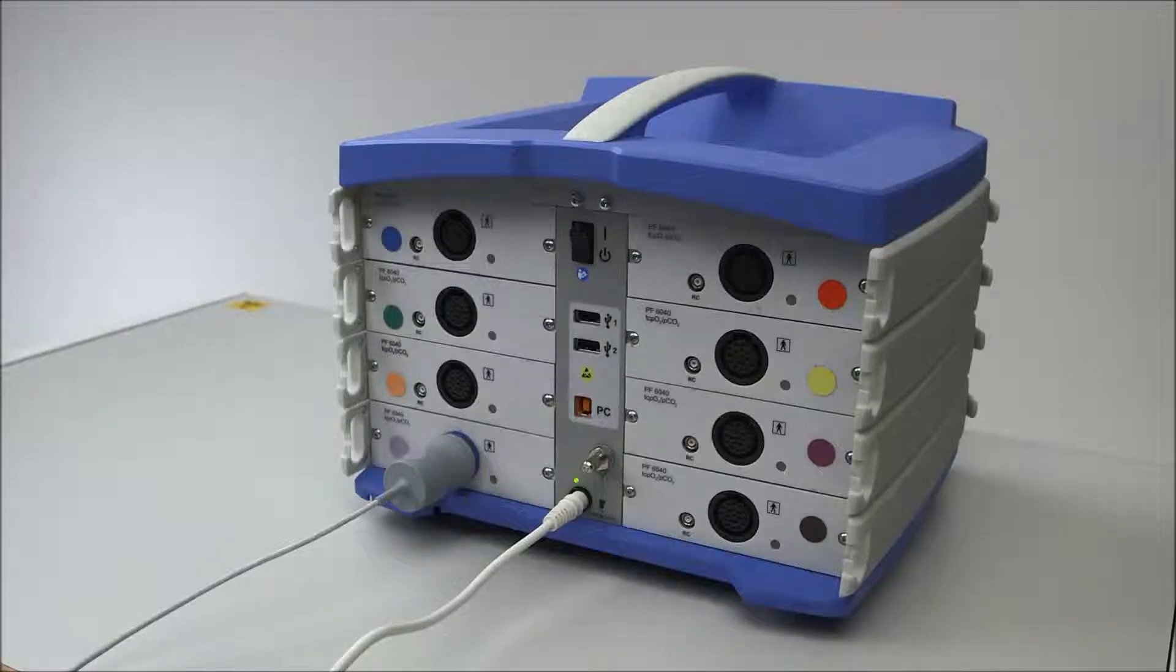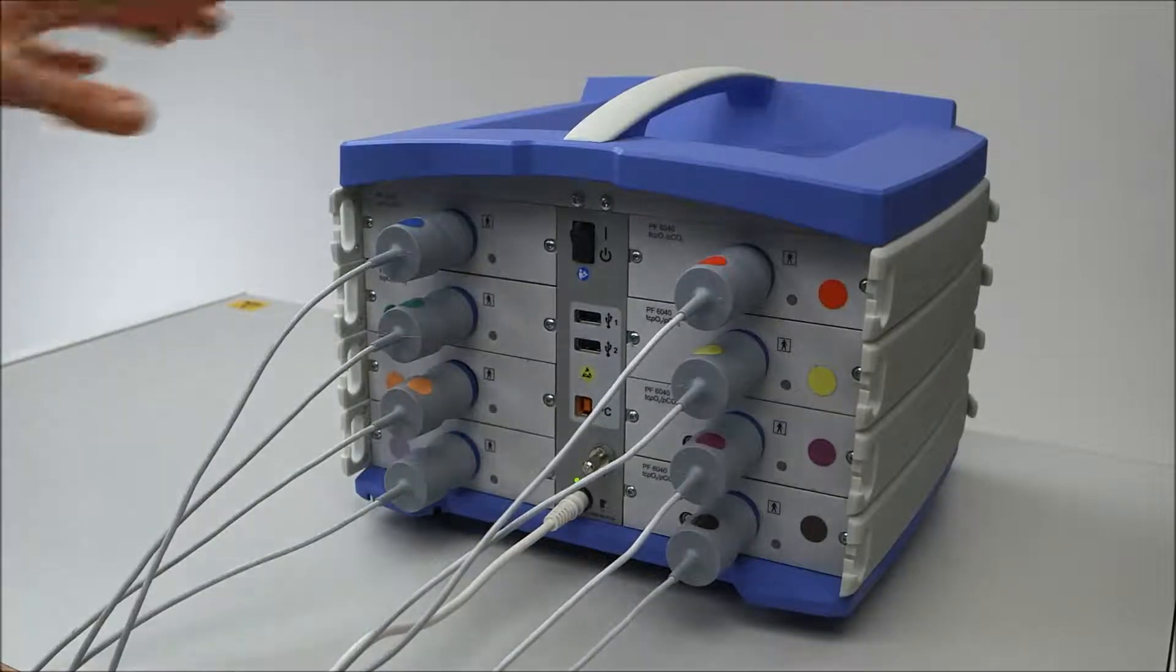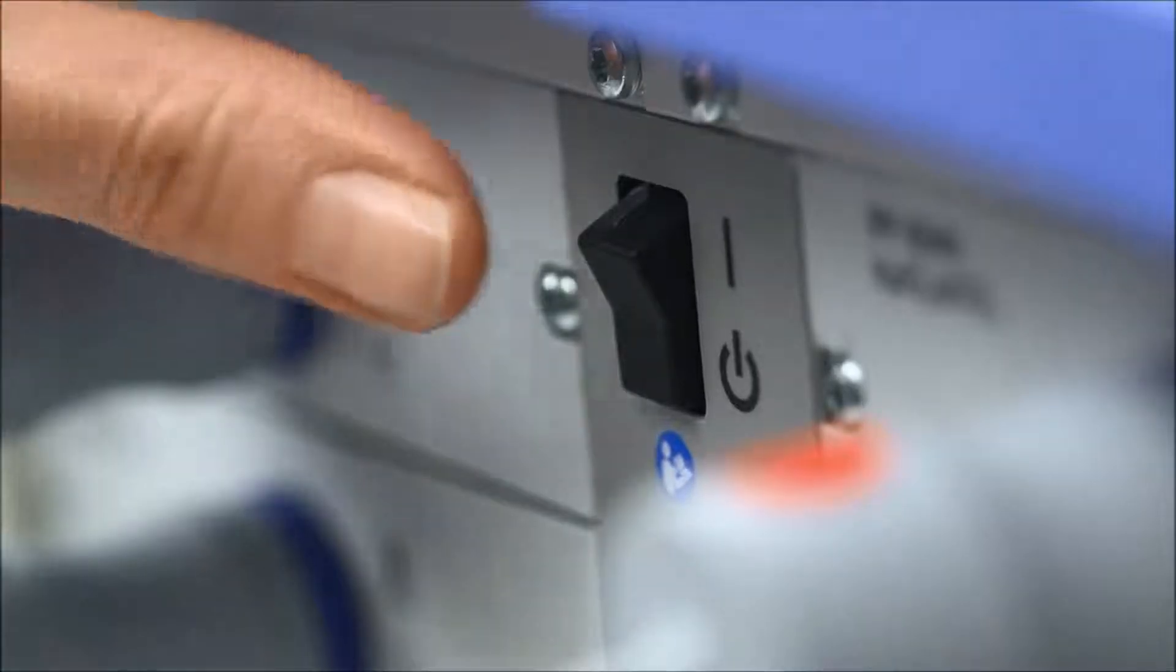You can connect up to 8 electrodes to the system. Power up the unit by pressing the switch at the back.